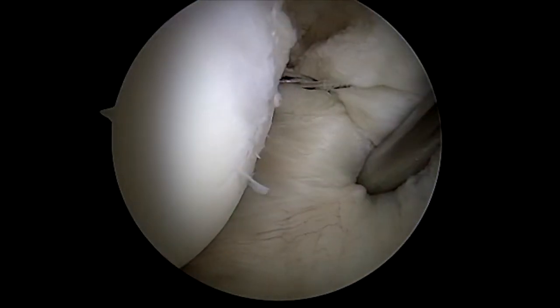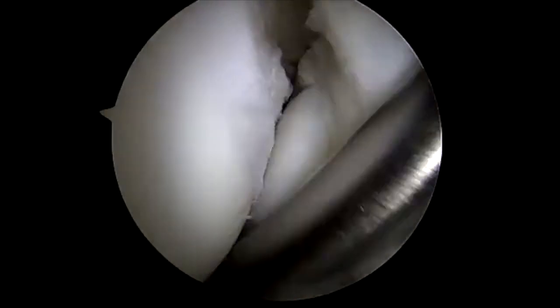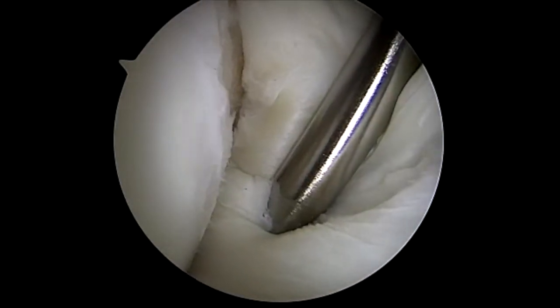You can see the trial reduction there. I then tie a series of knots outside the joint on top to reduce the rotator cuff, and there is the reduction.